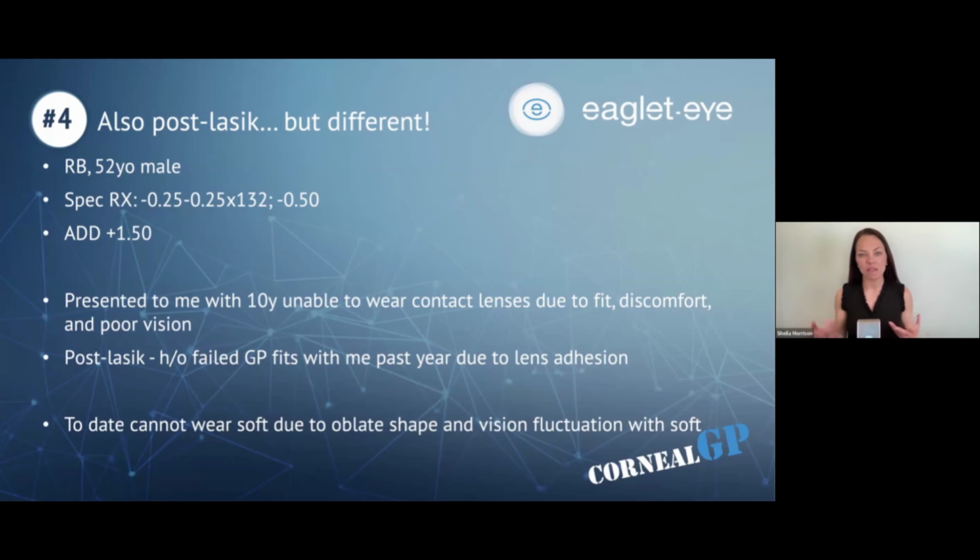So, we know that we can get to the finish line in a variety of different ways. In fact, there are many different ways that we can fit contacts, and more historical is not the wrong way. Fitting with a diagnostic set, with an expert fitter, can be done in a very short amount of time with a high level of precision. Now, on the other side of it, and I'd like to share a few cases, we really do have the ability today, very similar to OrthoK and sclerals, to design corneal GP lenses based on digital data.